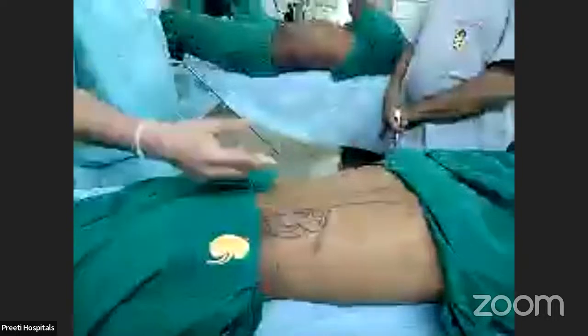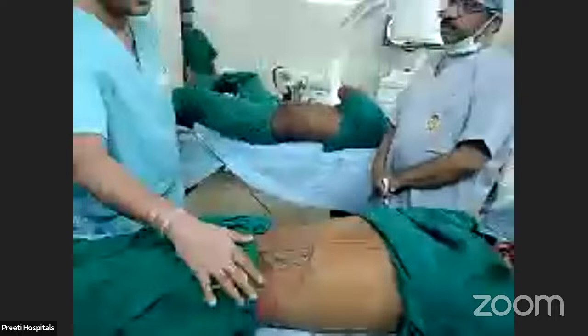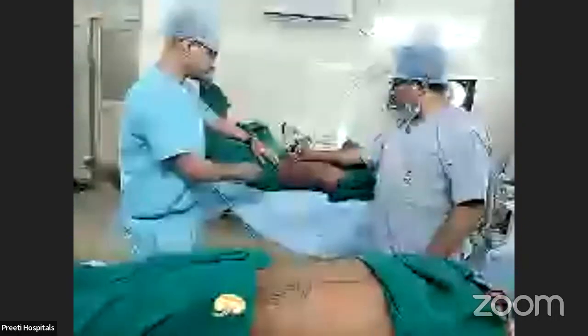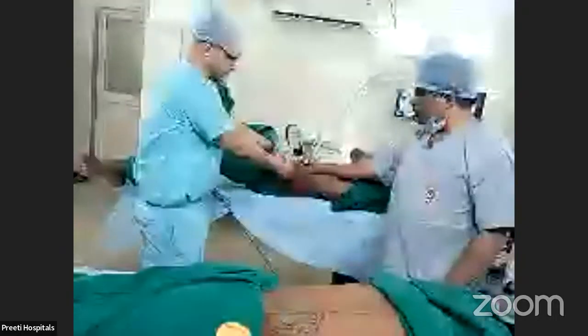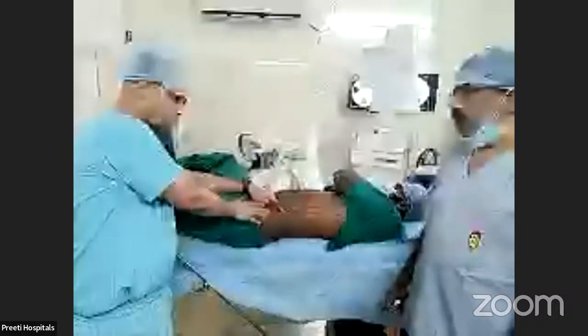Why? Because I will go at an angle of 45 degrees, and this iliac crest will not hamper my movements. Whereas here, if the calyx is parallel to the ureter and facing medially, vertically down, then this iliac crest will hamper my movements. For each step, for dilatation, for puncture also, it will hamper my movements. So prone PCNL is better for any single inferior calyceal stone.